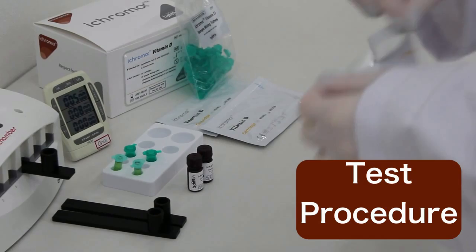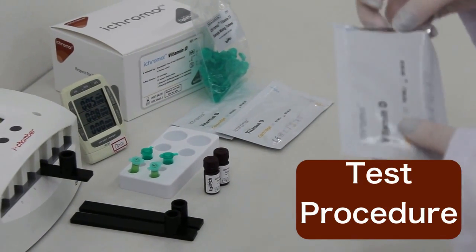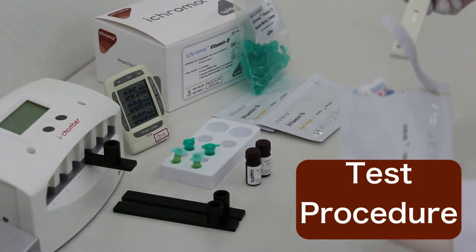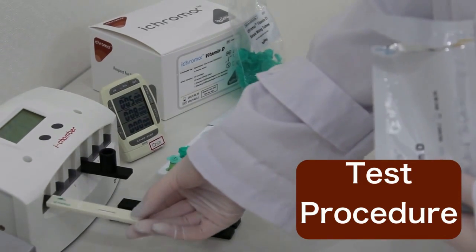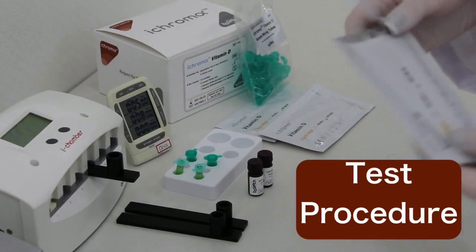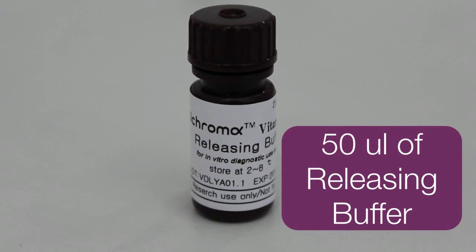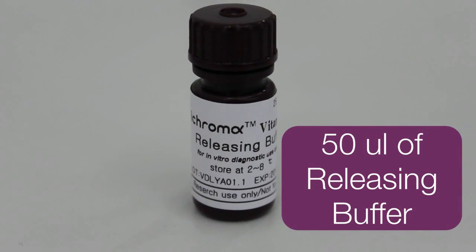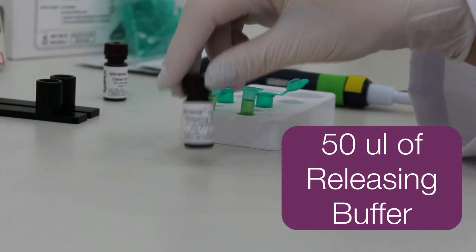Now, let's do the test procedure. Put the test cartridge into the iChamber slot. Transfer 50 microliters of releasing buffer into the sample mixing tube.